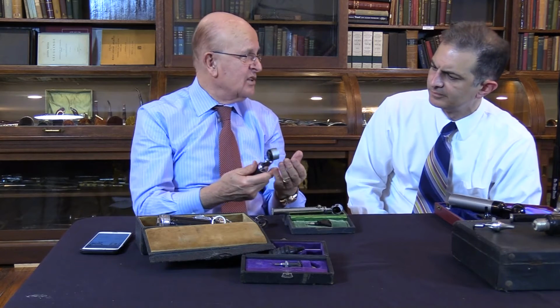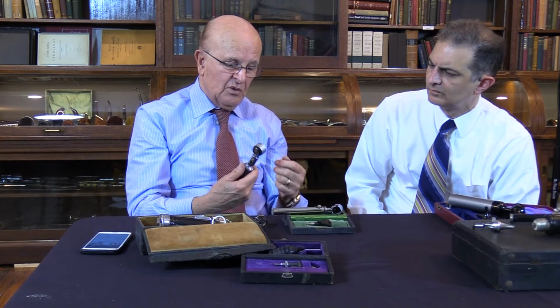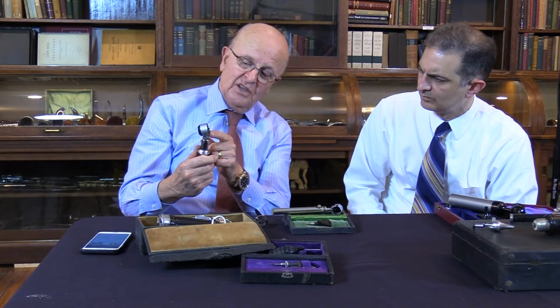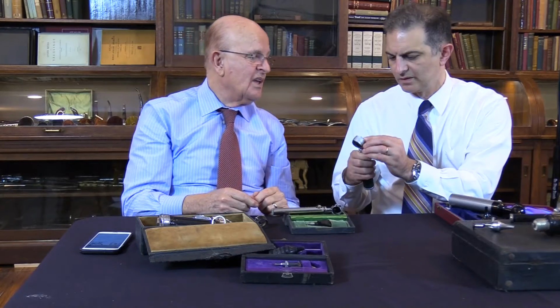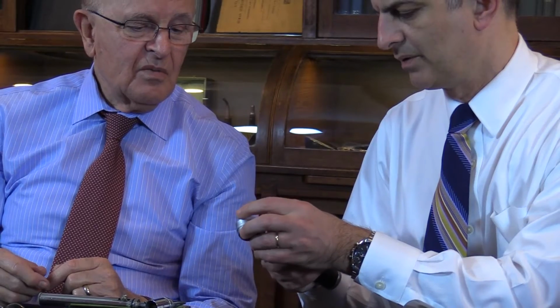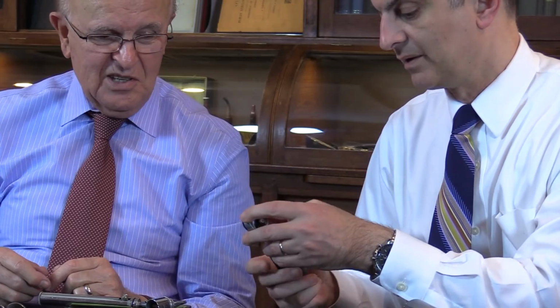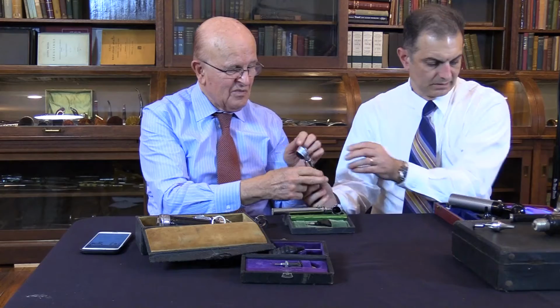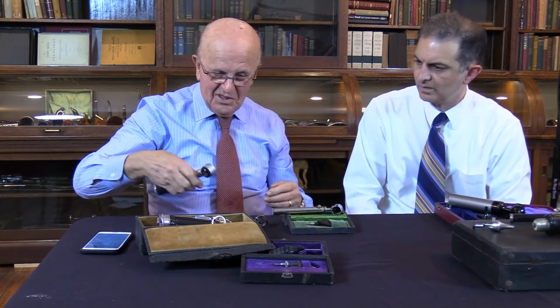I haven't seen anything like this before. It's so fascinating, because this is not for magnification. This is mainly for the light, because it's in the way of the eye, the vision. Yeah, probably back then you were still using a bulb. And now we don't worry about it as much because we've got more of a fiber optic light, where the light's a little more linear. Exactly. So this is how you lock it in place here.